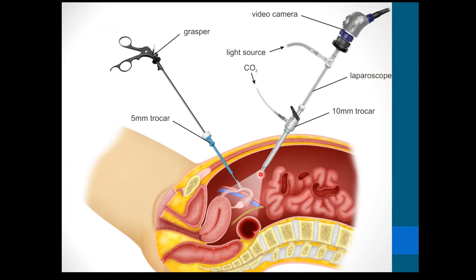When we do a laparoscopy, we actually readily see this pouch, because what surgeons often do is they put an instrument in the uterus and ask an assistant to push the uterus forwards in a very anteflexed position. And that exposes this area behind the uterus. And that is why on most laparoscopic images, the pouch of Douglas is very easy to see.